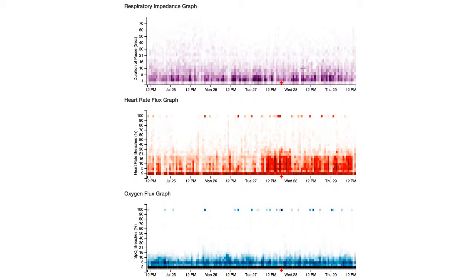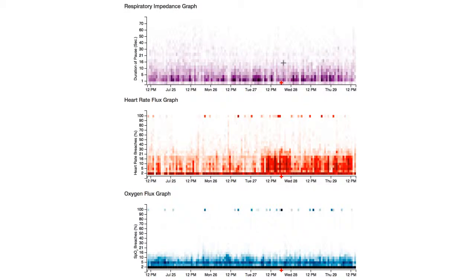The temporal intensity map allows the analyst to explore behaviors of temporal features discovered in the high-frequency data stream. Dense regions appear dark, thereby alerting the analyst of higher-than-normal activity. Specifically, the analyst is interested in regions that appear above a certain threshold. In the respiratory impedance graph, for instance, the analyst pays key attention to clusters occurring above the 20-second mark, as it is a pathological state for the infant.